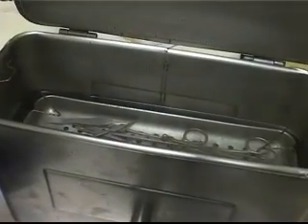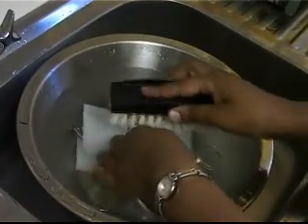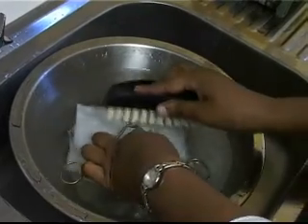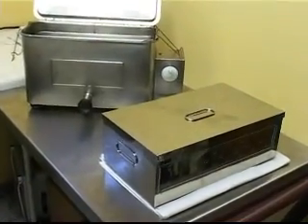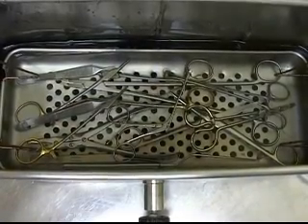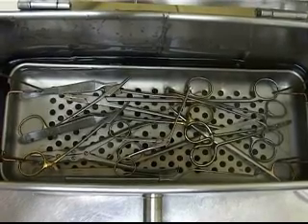Boiling in water is high level disinfection, not sterilization. Boiling will not kill organisms effectively if items are not cleaned properly. Boiled items must be allowed to dry before use or storage. Boiled items must not be left in the water to avoid recontamination.